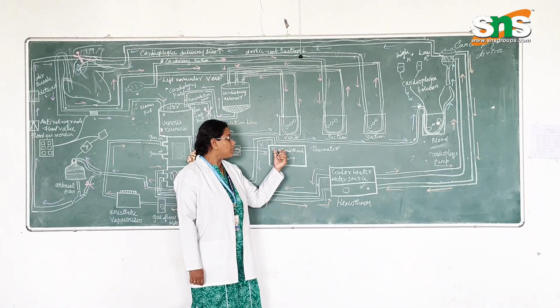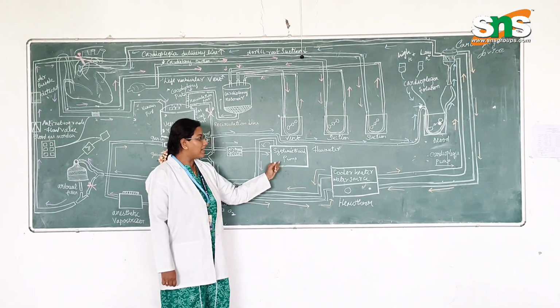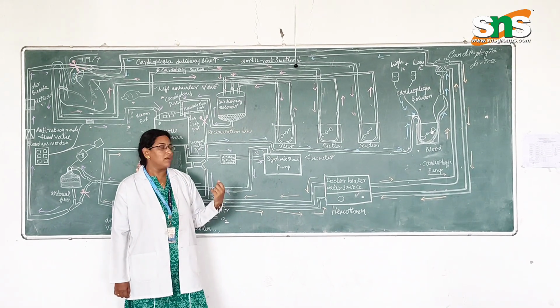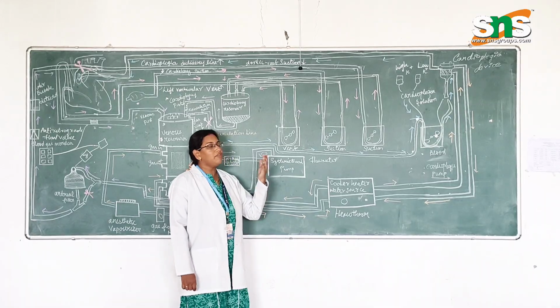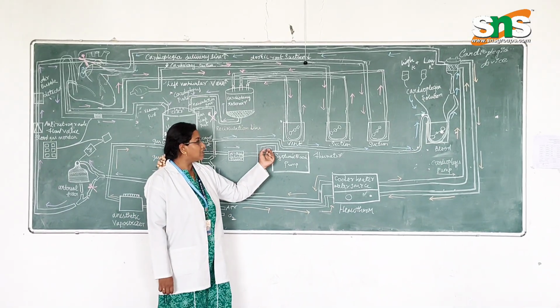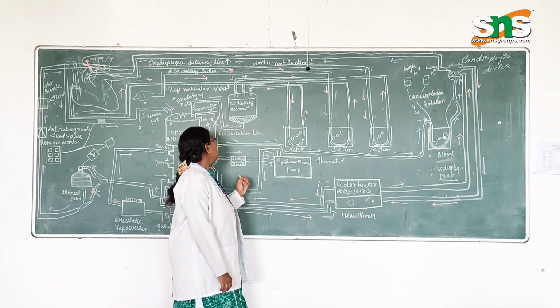So it is important that the perfusionist monitors the functioning of the roller pump before going into surgery. They need to check the direction of the roller pump and its functioning, and whether it has any runaway problem. If so, it has to be corrected before going on bypass. But if a failure occurs at the time of bypass itself, it is the responsibility of the perfusionist to change this line to another extra pump. Either the vent pump or the suction pump can be taken as the main pump for the surgery.